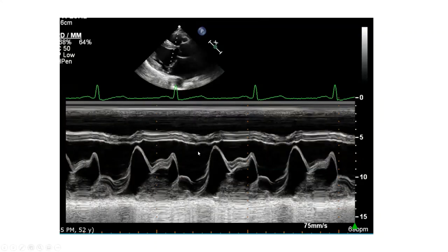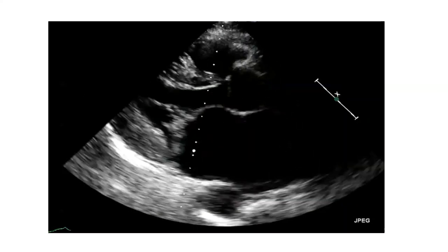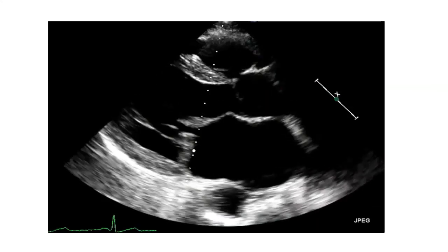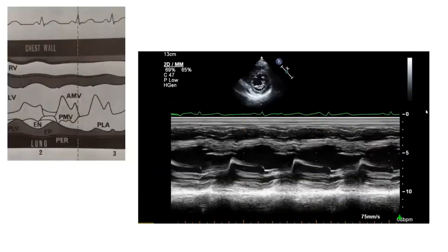Looking at this mitral valve envelope: as opposed to the anterior and posterior leaflets staying together at the end of systole, you see a hammocking or late systolic separation between the anterior and posterior leaflets. This is due to mitral valve prolapse. M-mode echocardiography is not generally how we diagnose mitral valve prolapse, but it does have its role in solidifying the diagnosis.